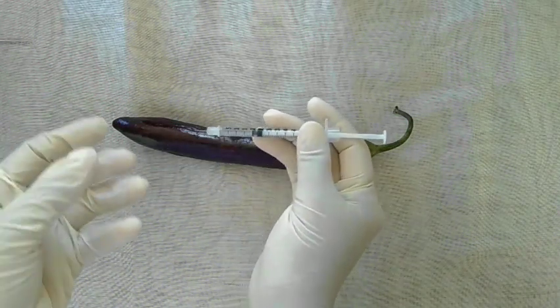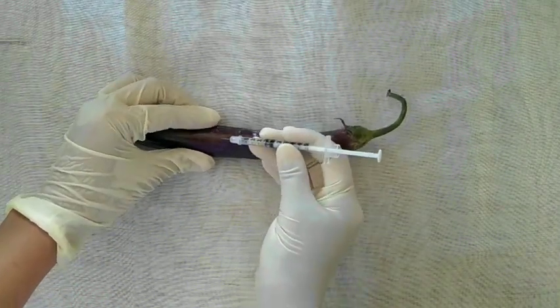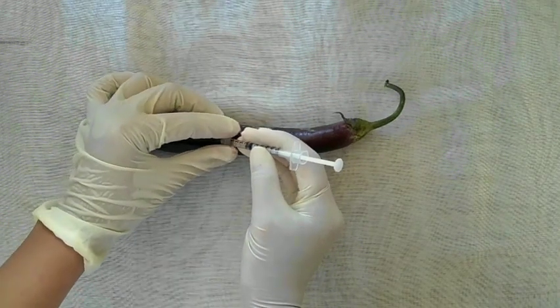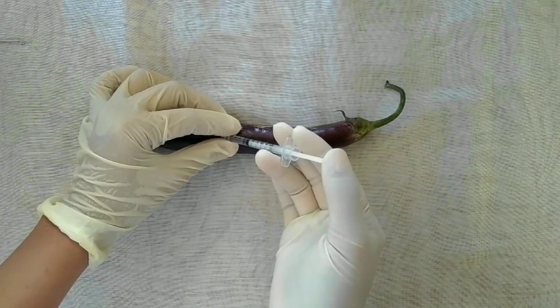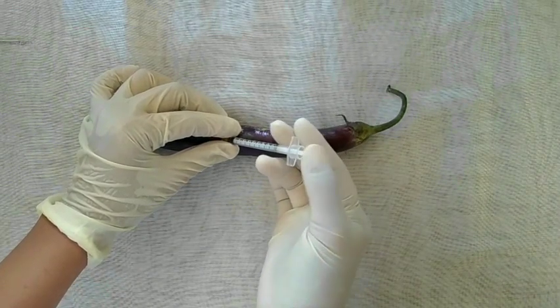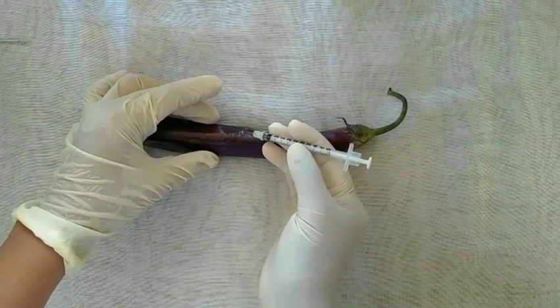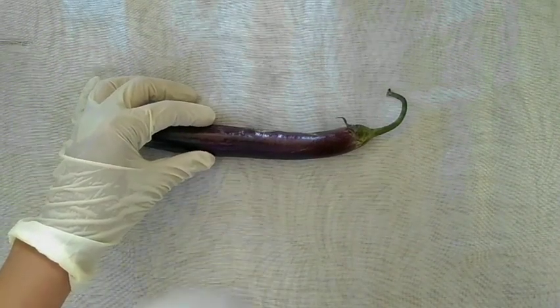So we are going to inject the needle at a 45-degree angle. Now release the pinched skin, then support the syringe, and we'll have to push the medication in. And after that, remove the needle at the same angle as it was inserted. Then dispose of the used syringe without recapping the needle. Then apply a clean cotton ball.